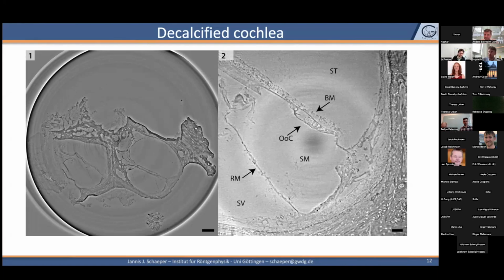So we went more in a way to have a model of the human temporal bone and the cochlea, which can be used in auditory research. For example, for simulations of the auditory pathway, where the position of the cochlea can get mapped with a frequency that is suitable for that hearing position, and to check for the implant positioning.